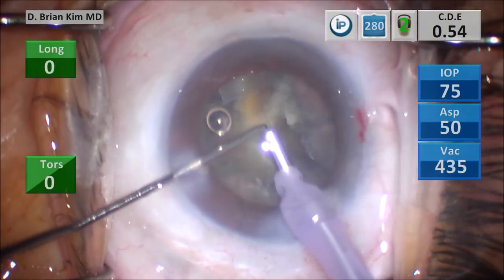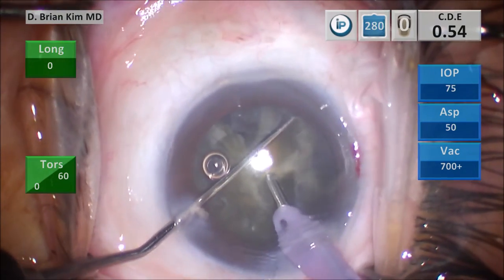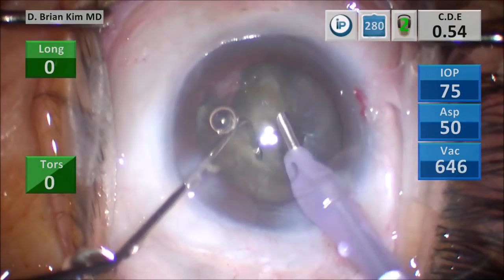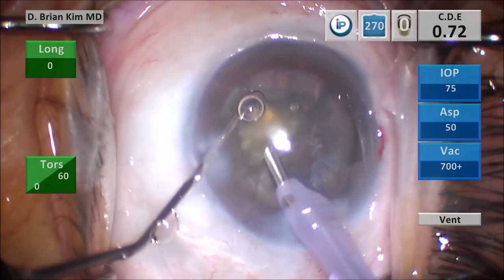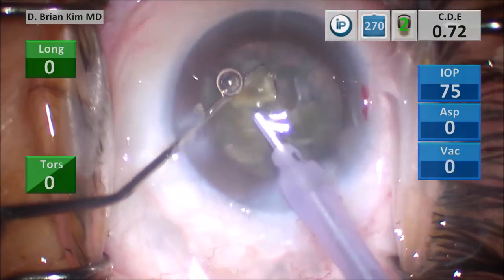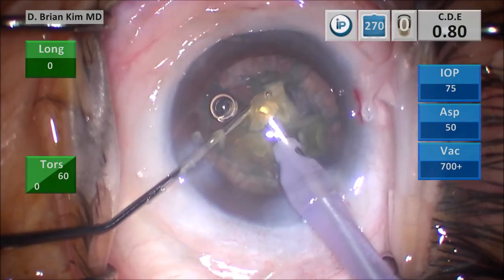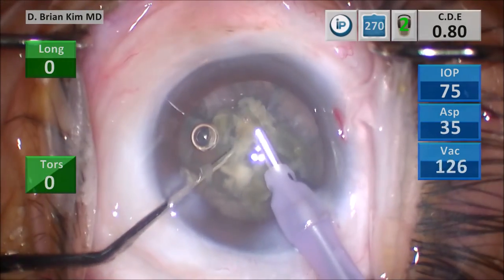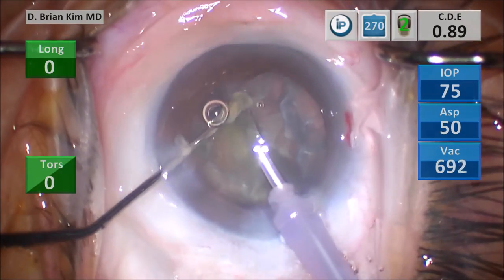This is the second part of that second quadrant. I place the chopper out and then I'm crushing the lens piece between the chopper and the phaco tip, continuing to do the mechanical fracturing where I'm bisecting and crushing the lens pieces into bite-sized pieces, orienting and manipulating them so that I can maximally crush the lens piece. Once the pieces are small enough, I'm going to start using high vacuum to emulsify the lens pieces, and when necessary I will use bursts of ultrasonic energy.